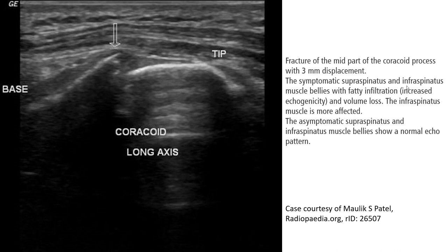This is an example of an ultrasound of the coracoid process, which we can see in this view. The arrow indicates the coracoid alignment — this is a fracture.